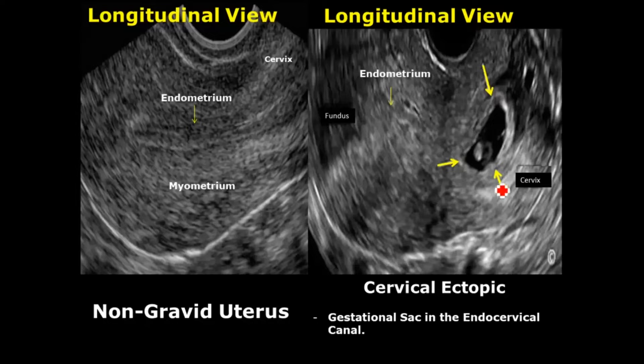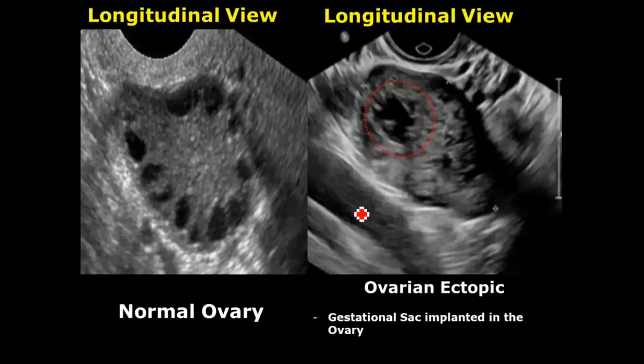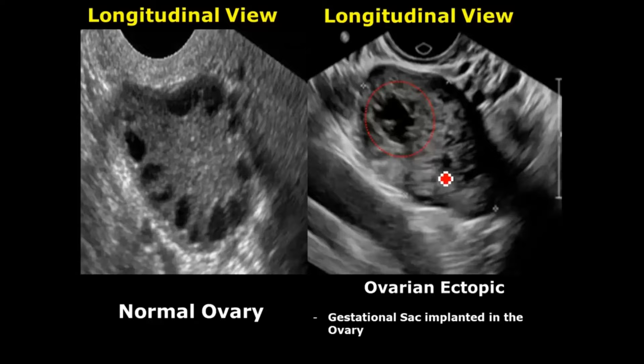Cervical ectopic is a rare form of ectopic pregnancy in which there is a gestational sac in the endocervical canal. Normally the pregnancy should be located in the endometrial canal implanted inside the endometrium. An ovarian ectopic is another rare form in which the gestational sac will be located inside the ovary — here we can notice a gestational sac with a small embryo located within the ovary.